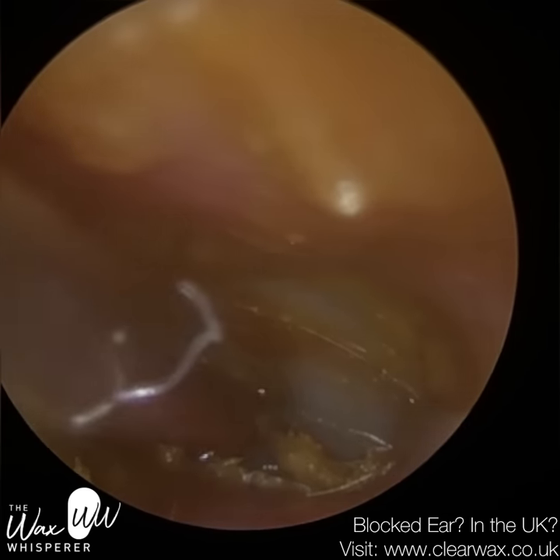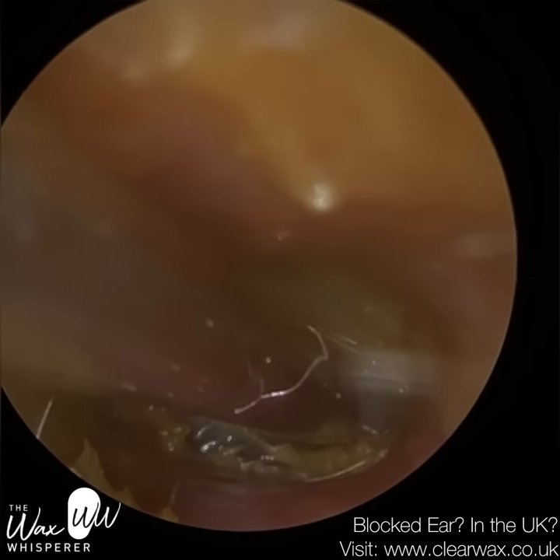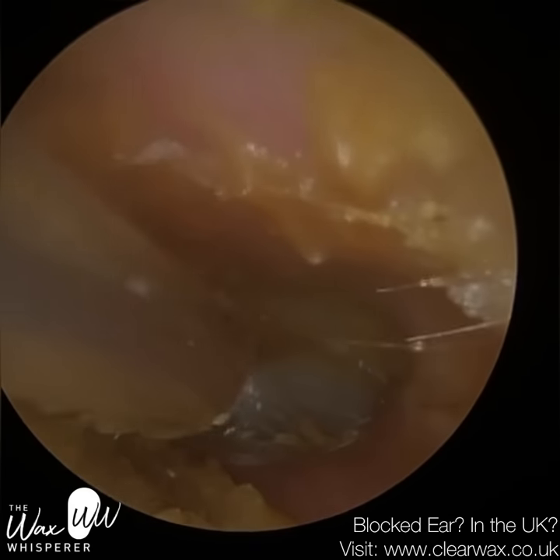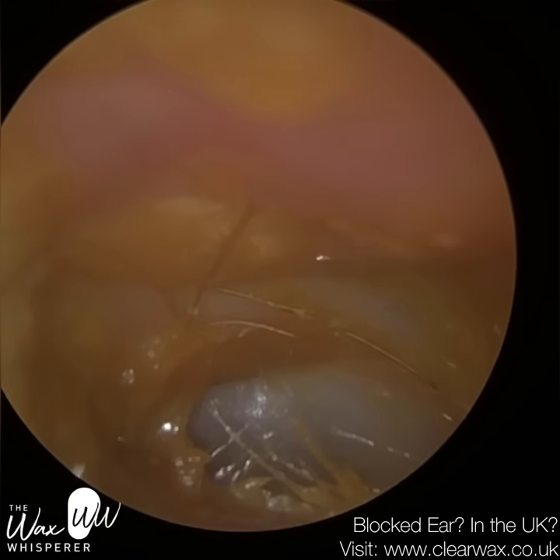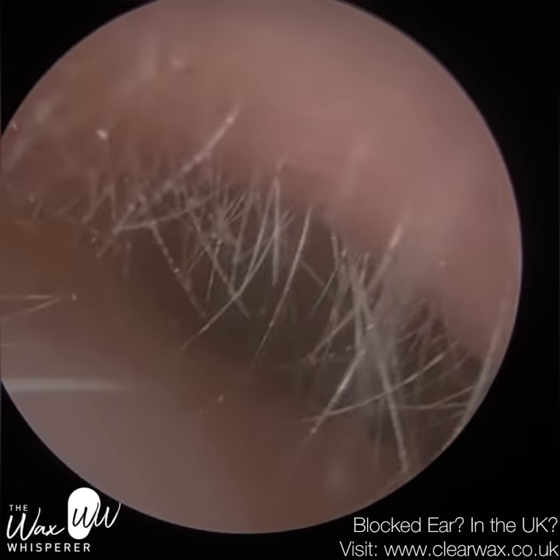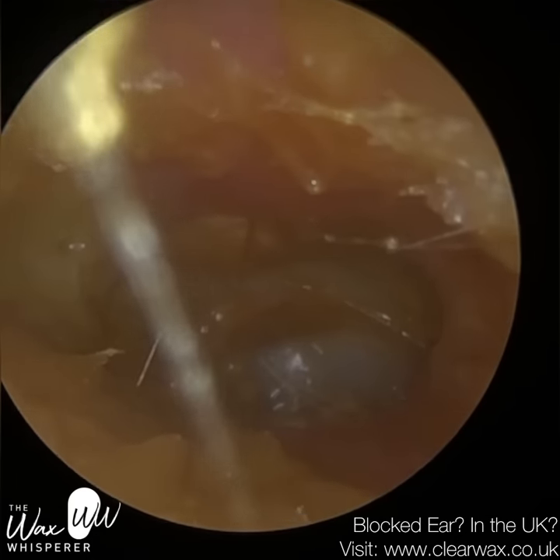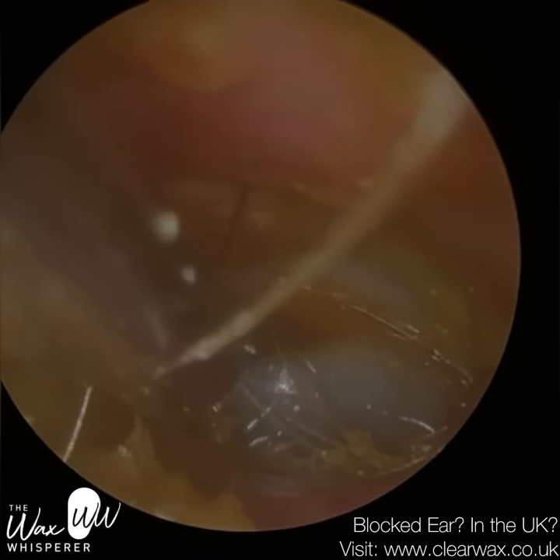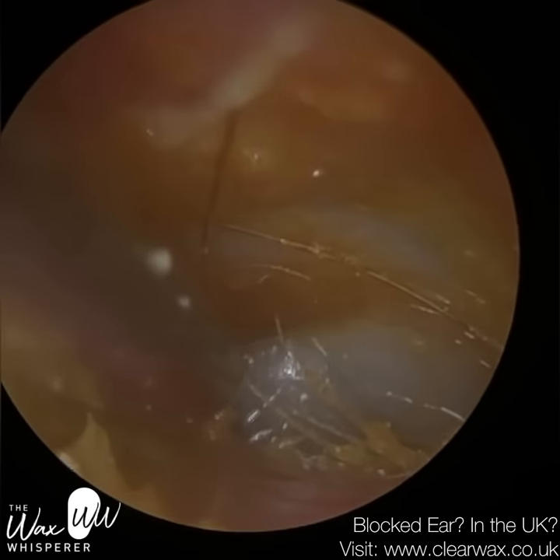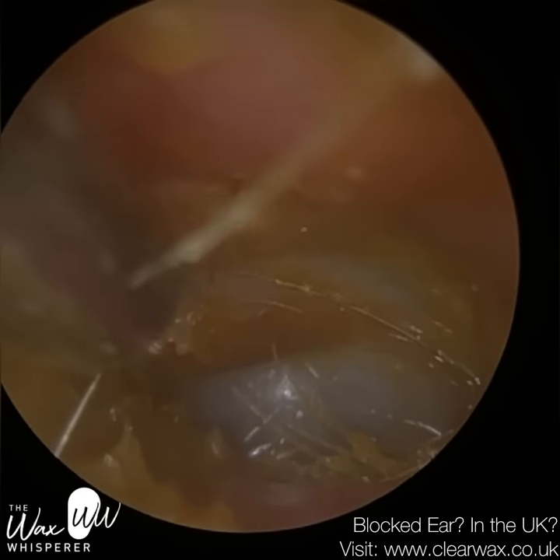There are a few hairs here. The patient did say that they're not poking the ears, and I've got no reason to doubt them, but there are a few hairs. That could have been from historic ear syringing, possibly — that's just flushed them further down into the ear. But hopefully they're not poking in the ear, because we have to ask ourselves why these hairs are up here right against the eardrum.